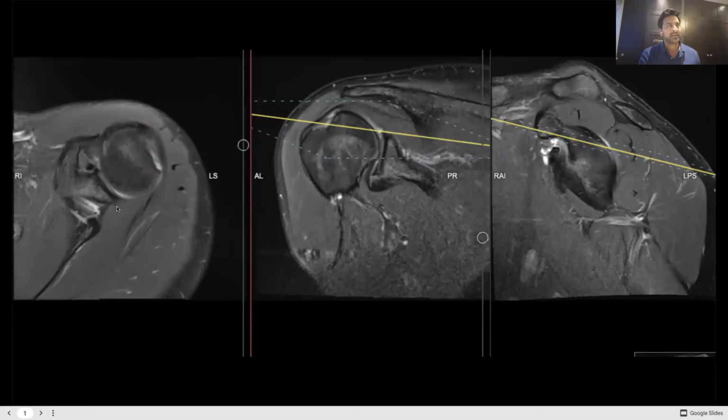So that's not great. And then we also thought, okay, if they had an anterior inferior dislocation, what will happen here is that this would go forwards like this, impact here, and then come back again. So now we've got to try and pay attention to this area over here on all the views.